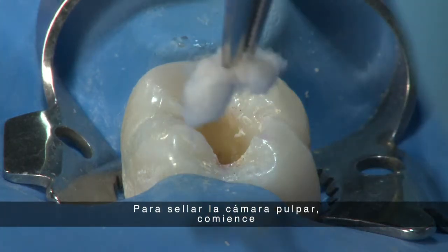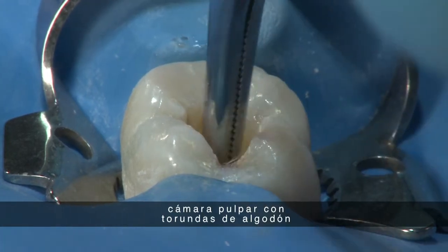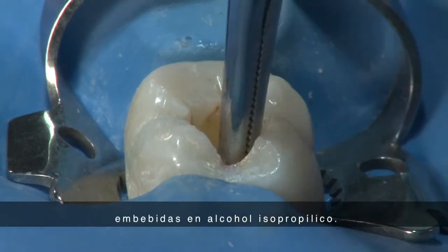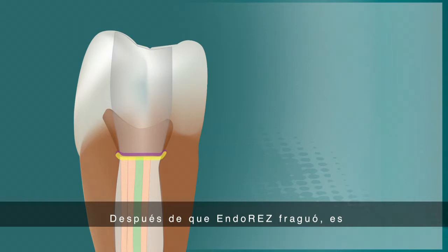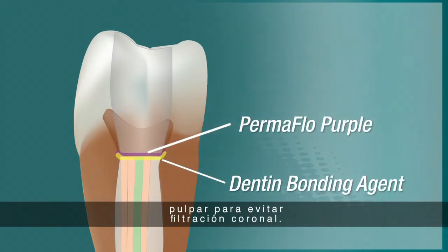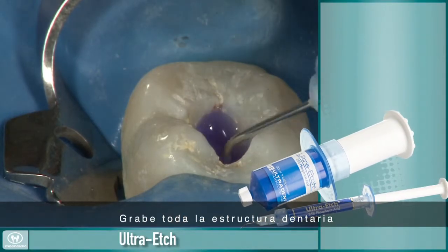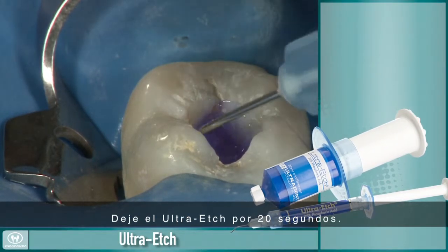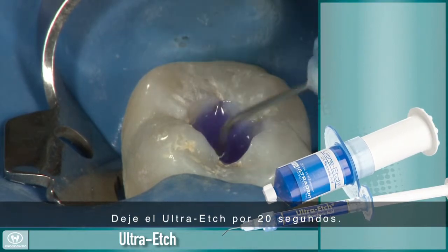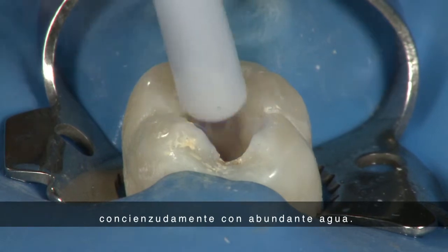To seal the pulp chamber, begin by cleaning the walls and floor of the pulp chamber with cotton pellets soaked in isopropyl alcohol. After the EndoREZ has set, sealing the floor of the pulp chamber is important to prevent coronal leakage. Etch the entire tooth structure inside the pulp chamber. Leave Ultra Etch for 20 seconds. After 20 seconds, rinse tooth thoroughly with copious amounts of water.